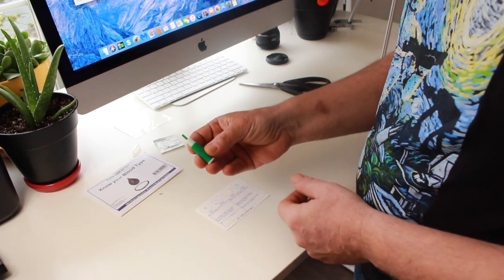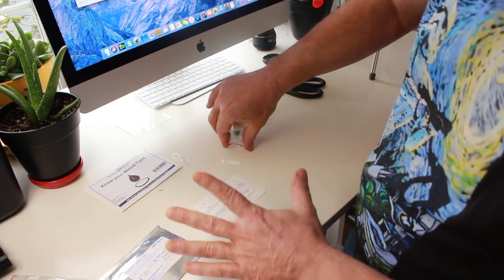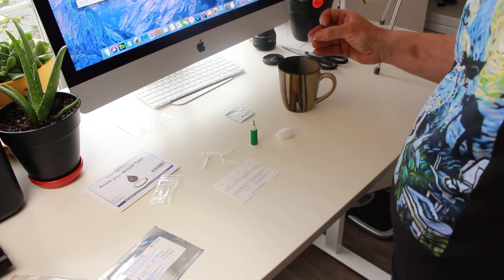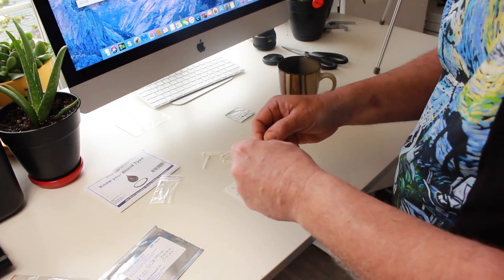This is what pokes you, and you twist and pull this thing off, and there's a needle in here, one time use. Careful not to touch things too much. Everything should be very sanitary. I'll put a drop of water in each of these, and once I do this, I have very little time.